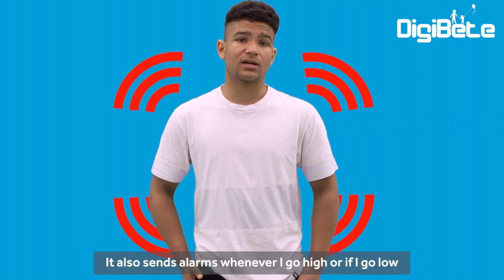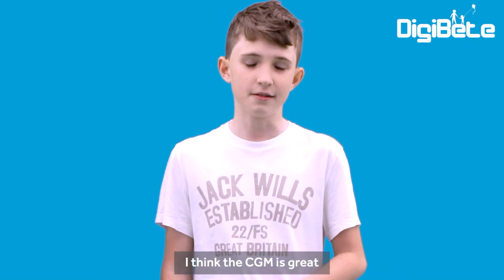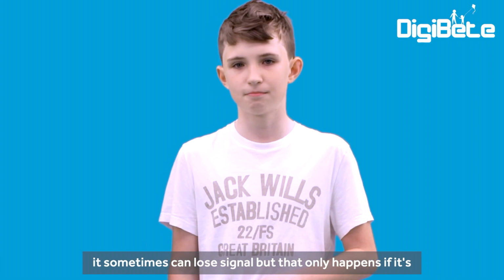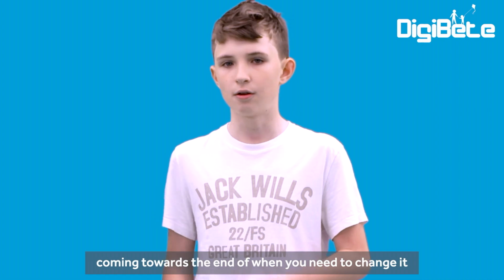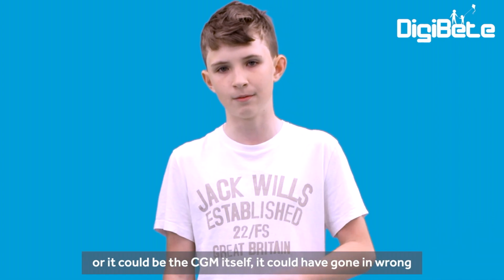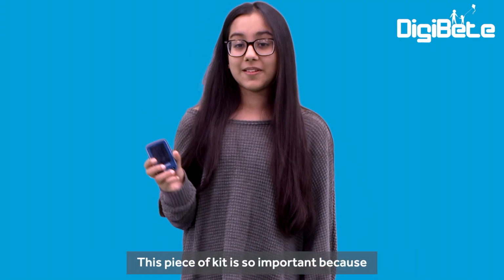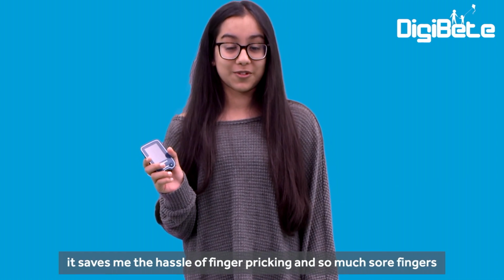It also sends alarms whenever I go high, if I go low. I think the CGM's great. It sometimes can lose signal, but that only happens if it's coming towards the end of when you need to change it, or it could be the CGM itself, it could have gone in wrong, but it reads your blood sugars really accurately. This piece of kit is so important because it saves me the hassle of finger pricking and so many sore fingers.